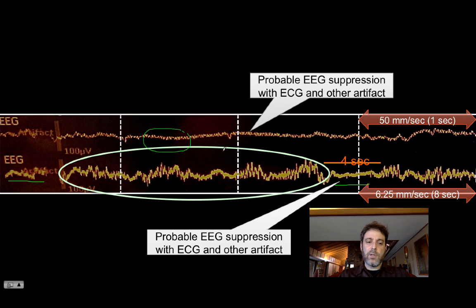And here the burst, before the suppression and maybe after a suppression that occurred before, it looks like delta spindle activity. Here is nice spindle waves, and you can, I think, see these underlying delta waves there as well.